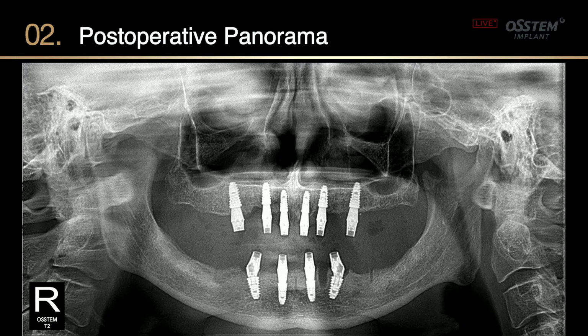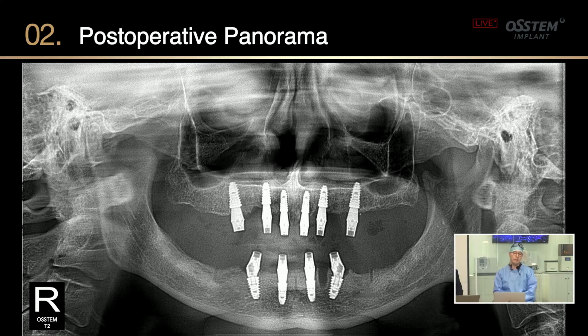Actually, the surgery was finished successfully, but it was not done all by me. All-on-4 is not a routine procedure in Korea. I have done about a dozen of them.